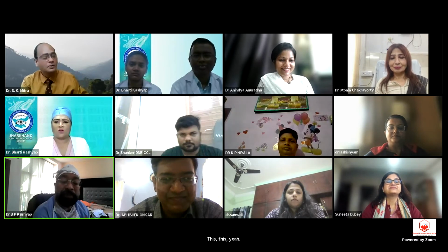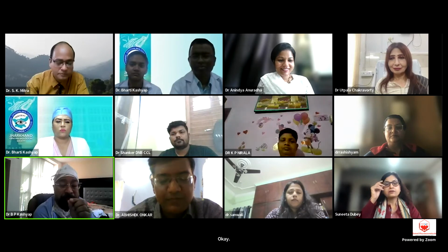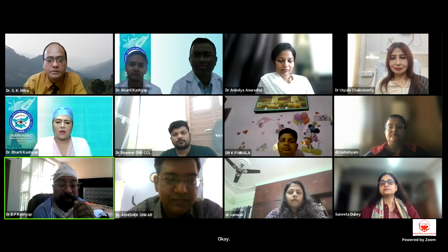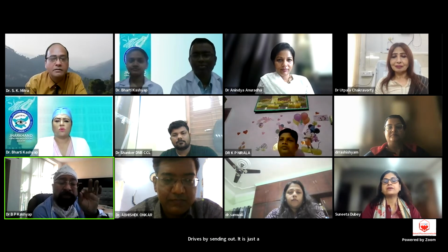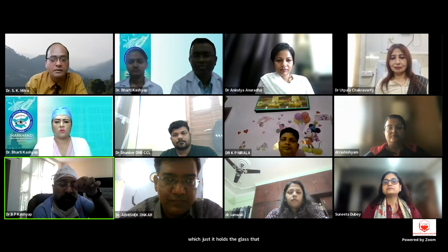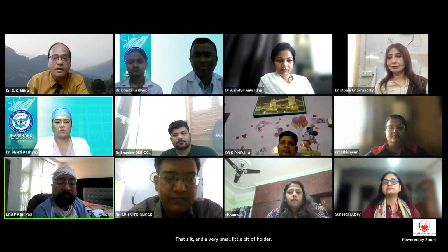So you don't know, but there is a special kind of trial set in which the rim is not there. The normal trial set is not like that. It is just a very small rim all around, which just holds the glass. That's it, and a very small little bit of holder. So it does not give you the ring effect on the visual field.